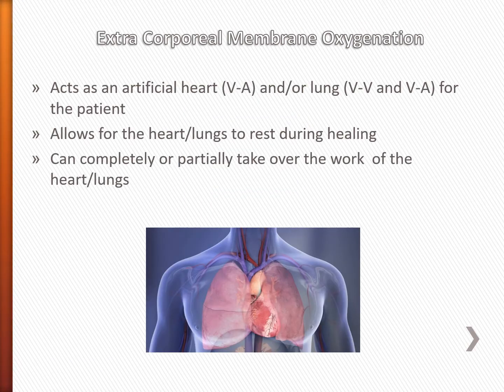ECMO stands for Extracorporeal Membrane Oxygenation. ECMO can act as the artificial heart and/or lungs for the patients. It can allow the heart and lungs to rest during healing. It can completely or partially take over the work of the heart and lungs.